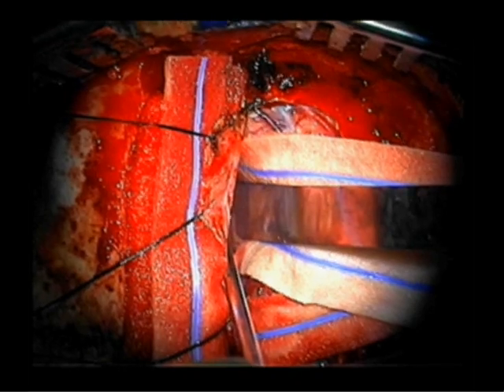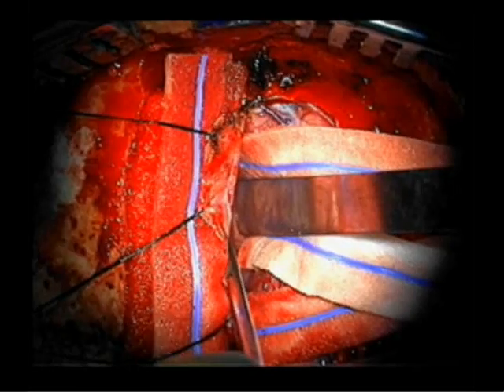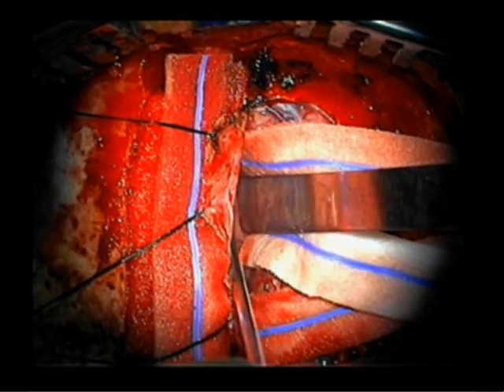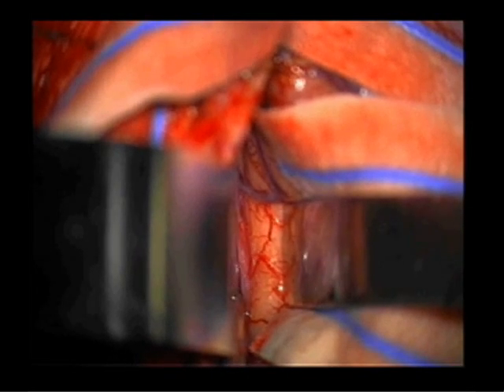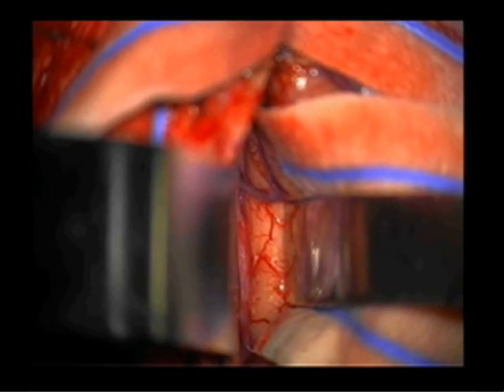Bleeding from the overlying superior sagittal sinus may be controlled with Surgicel, gel foam, and cottons. Careful placement of retractors in the interhemispheric fissure allows visualization of the underlying callosal marginal and pericallosal arteries.